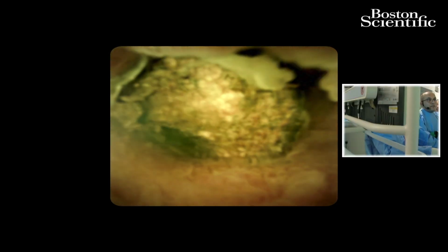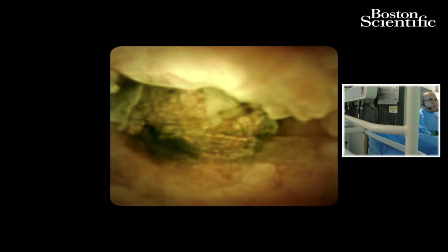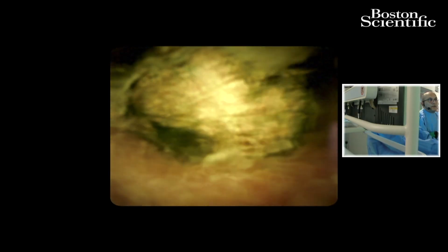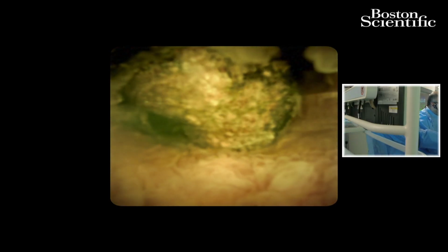Dr. Khalid, yeah. Okay. Now Dr. Fisher did a good job. He cannulated by cholangioscope. This Boston ES cholangioscope, spyglass. And now we have the spyglass, the laser probe. We'll see how to crush this stone by laser probe. Actually, we don't have any experience in laser lithotripsy, but Dr. Mohammed will tell us what is the main principle for this lithotripsy by laser.